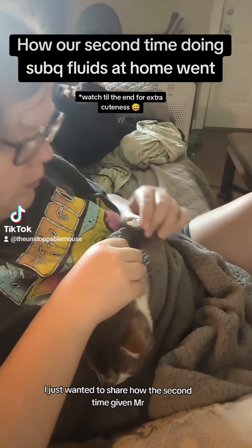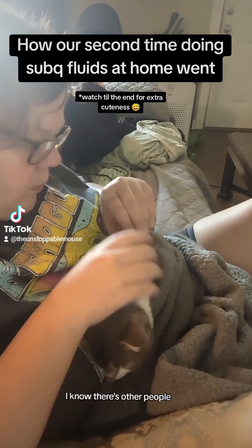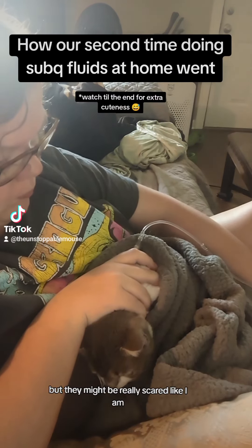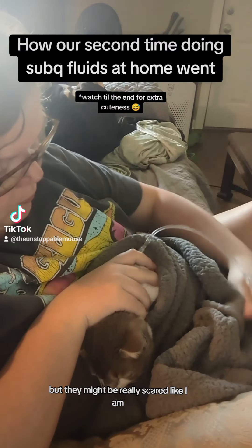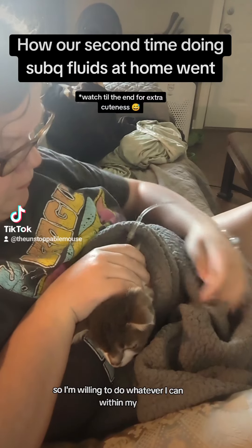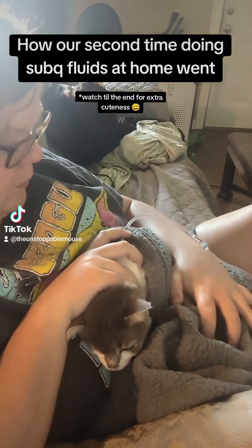Hey y'all, I just wanted to share how the second time giving Mr. Mouse subcutaneous fluids at home went, because I know there are other people who are thinking about learning to do fluids for their cats at home but might be really scared — like I am and have always been — but I do love Mr. Mouse so I'm willing to do whatever I can within my capabilities.